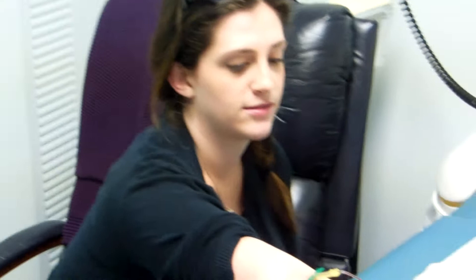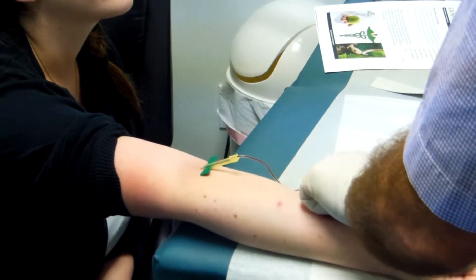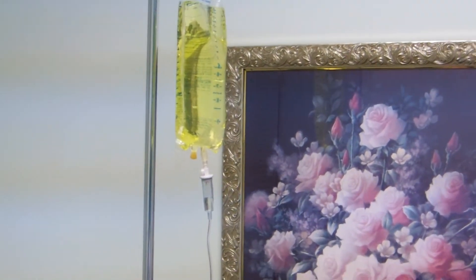She's still smiling. Connect this. Check for patency. It's running beautifully, flushing nicely.